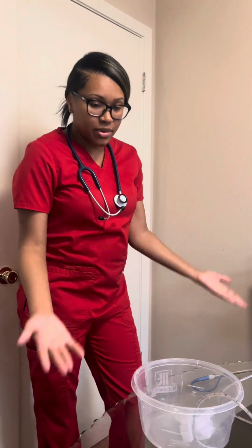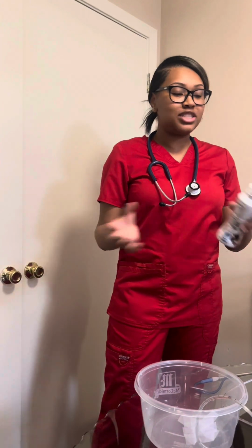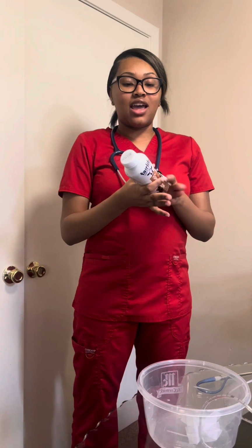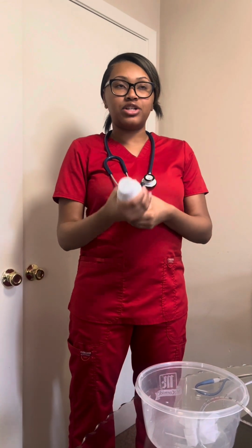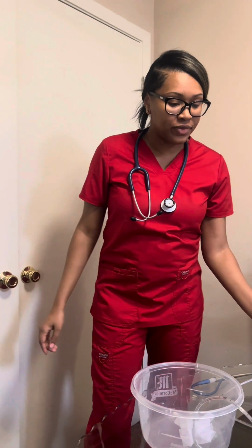Then I would raise the bed to working height, lift the side rail down, and I will place the patient in semi-Fowler's position. I will check the expiration date, and I will also make sure it's not open or punctured, and I will also make sure that it is room temperature.